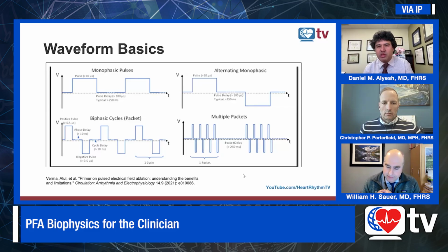Yeah, I think it was a very interesting read, trying to understand some of what goes into a waveform. Some of the things that I also read were that there are trade-offs with skeletal muscle recruitment that you can see depending on how you construct your waveform. Delays between delivering packets can allow the tissue to rest to avoid thermal effects, but it lengthens the duration of the ablation. And so these are all a little different with each product that we're evaluating, but all go into the recipe.